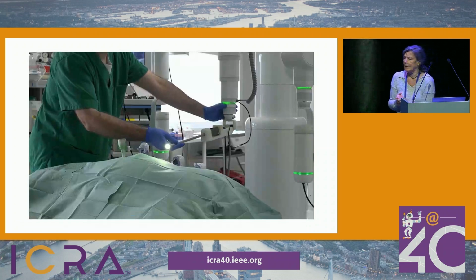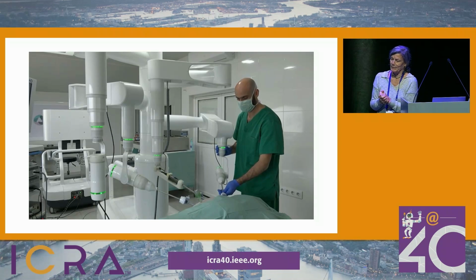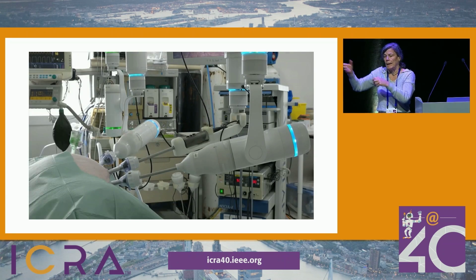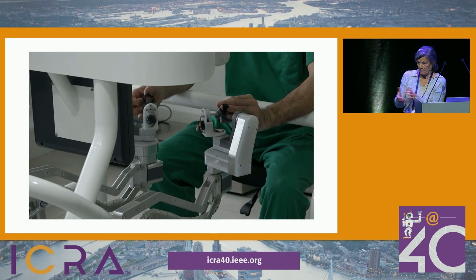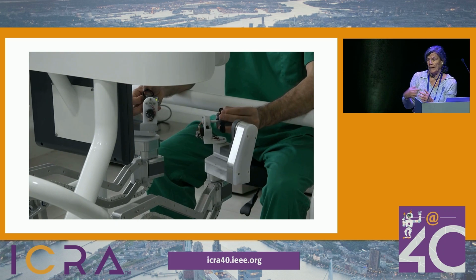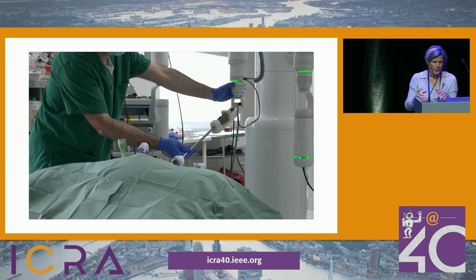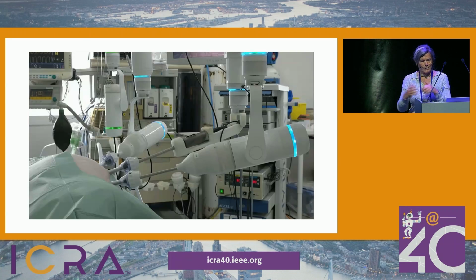So what we can see here is the setup of the robot, which is very quick. We don't need to manage all the links of the robot because we have small redundancy, one in some arms and not in the others. So the question is whether all the arms have to be redundant or only some of them.